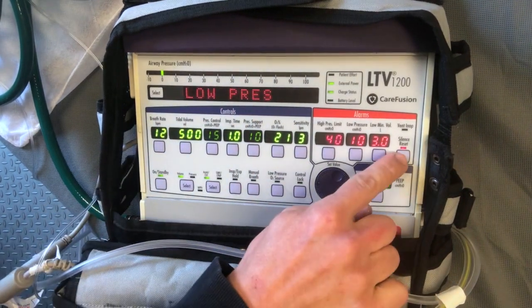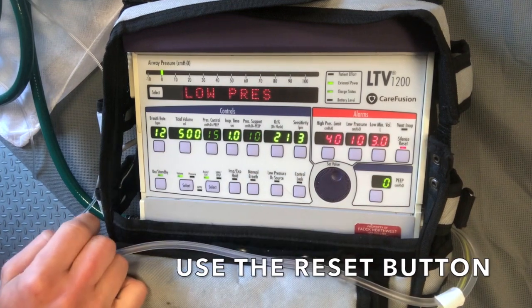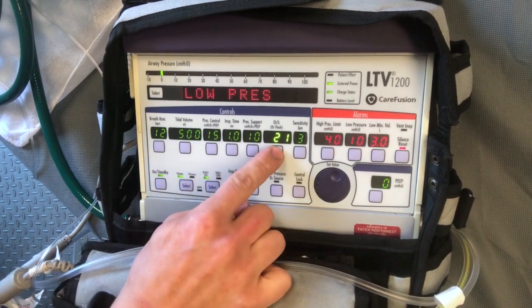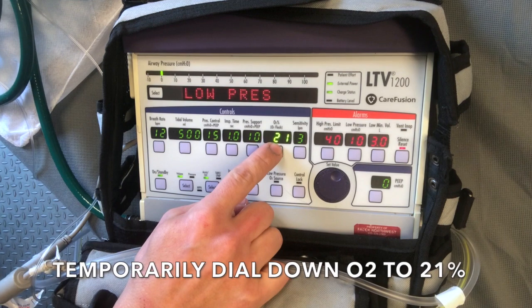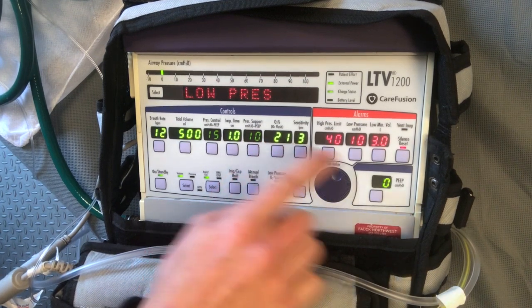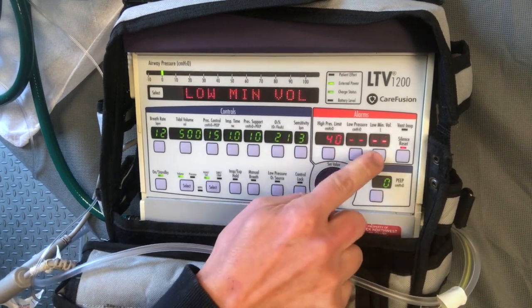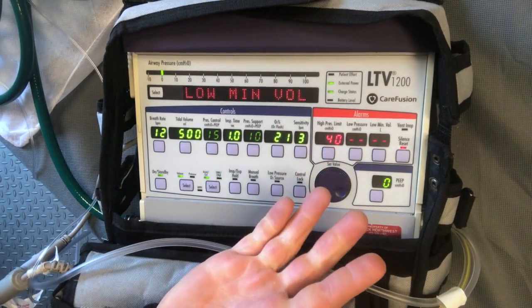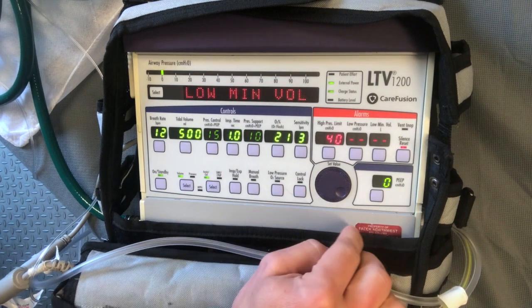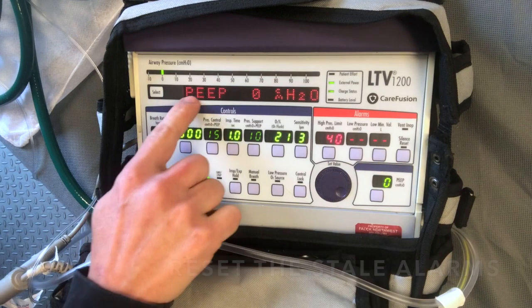To make it easier, set your FiO2 to 21%. Now dial down the low pressure alarm and the low minute volume alarm. Now you can interact with the interface of the vent. Use the Silence Reset button to reset your alarms.